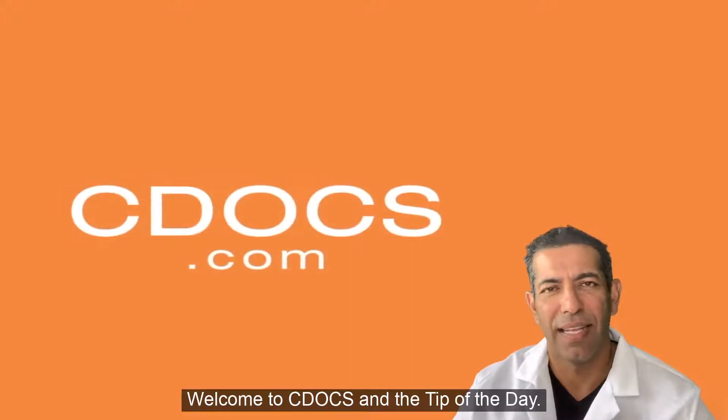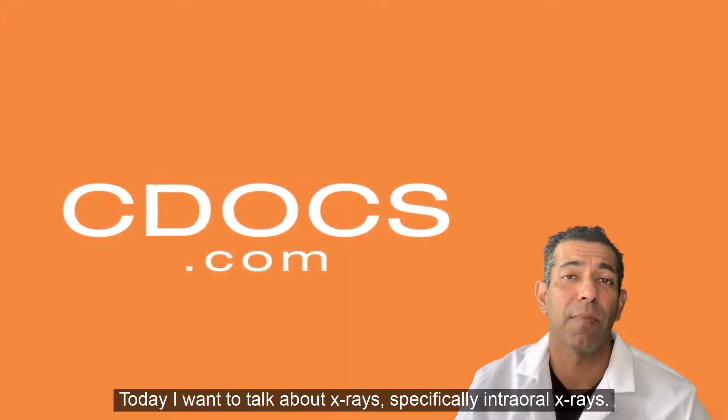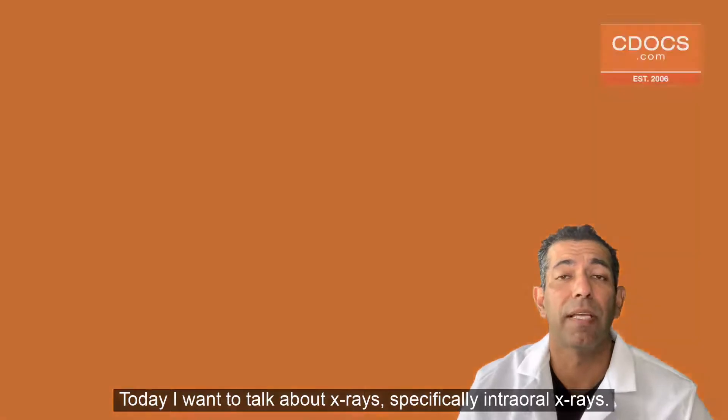Welcome to C-Docs and the tip of the day. Today I want to talk about x-rays, specifically intraoral x-rays.